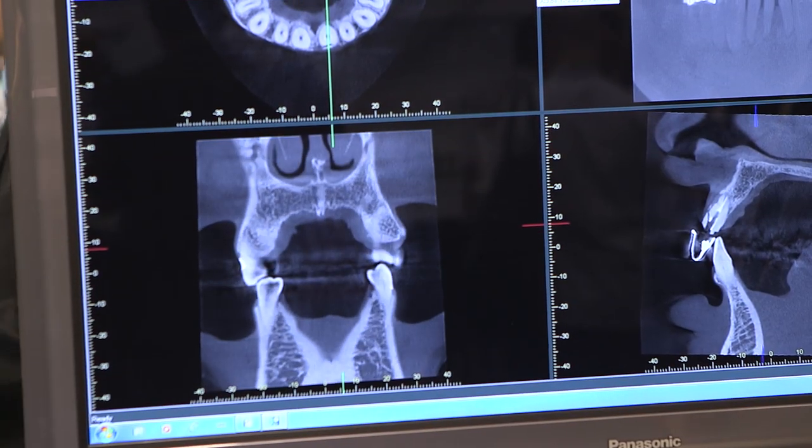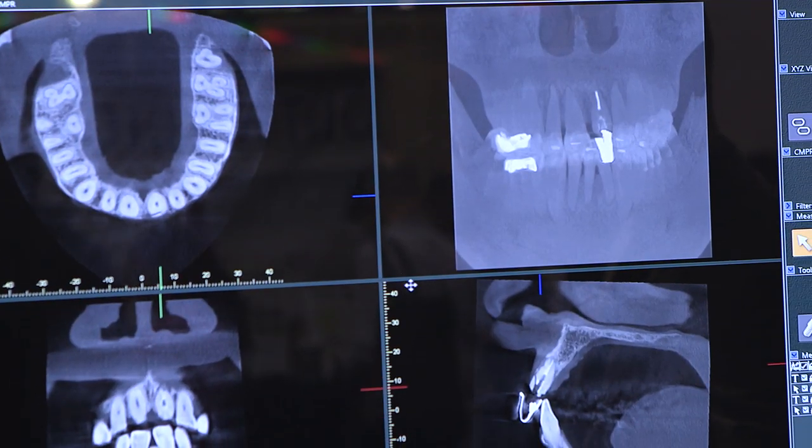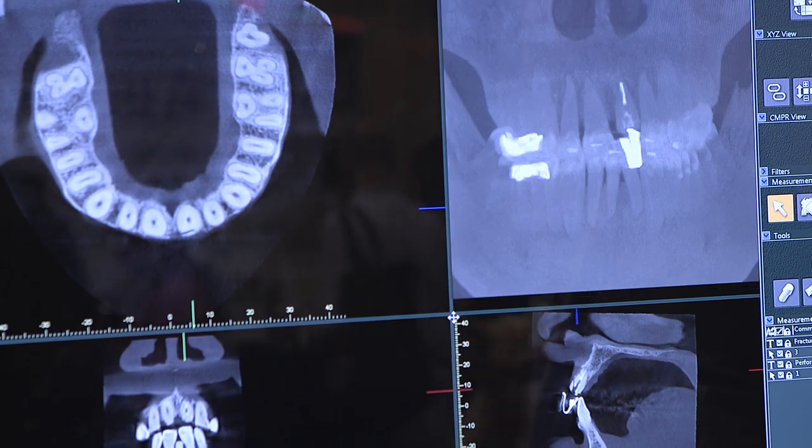Another really important thing about Morita is the image quality. Morita is known internationally for our high image quality, and the R100 is just another machine within that product line known for image quality. Another really important part about the R100, as well as the entire Morita product line, is our ease of use. We've made it very easy for the staff to use the machine and acquire consistent images for the clinician.